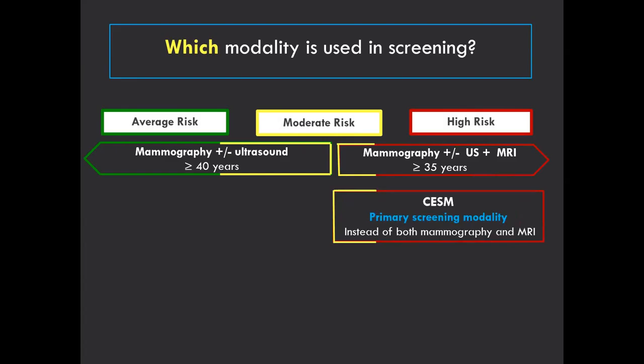If we look at contrast mammography, we will find that it has the potential to be used as a primary screening modality for this group of patients.